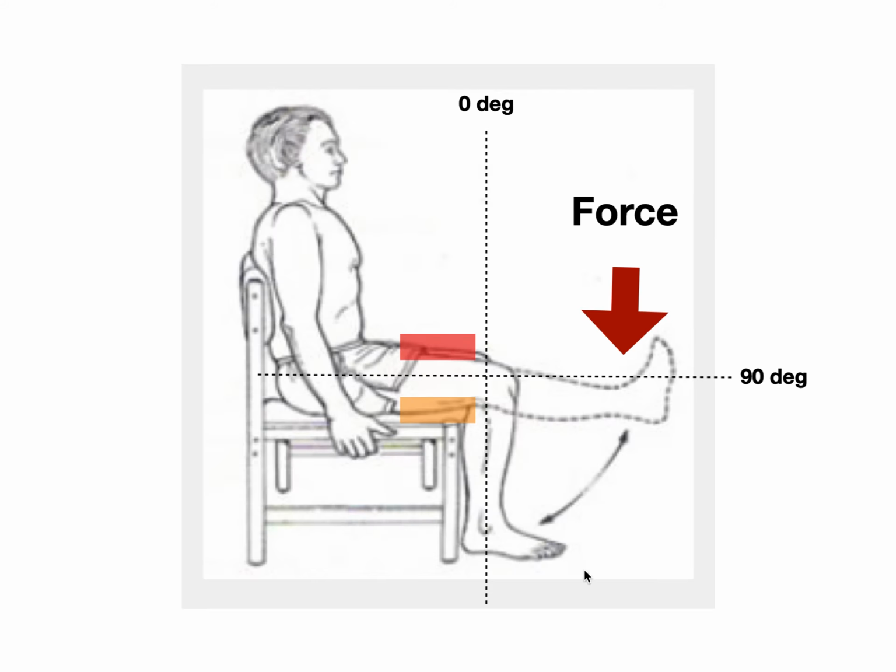So after exercise 1, we've tried to describe the motion with our knowledge in anatomy. And then in exercise 2, we're trying to use EMG to prove our answer to see if that's correct. So here's the example. You've got the guy sitting on the chair with his knee extended.